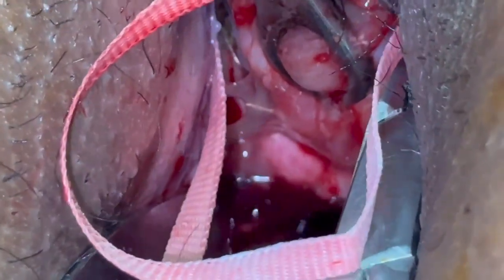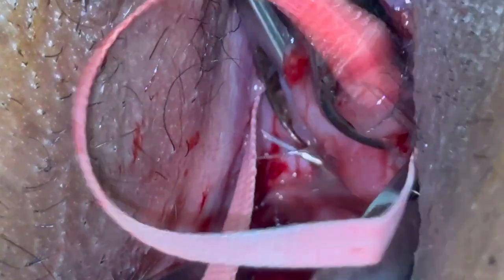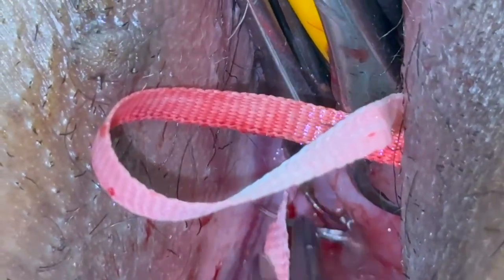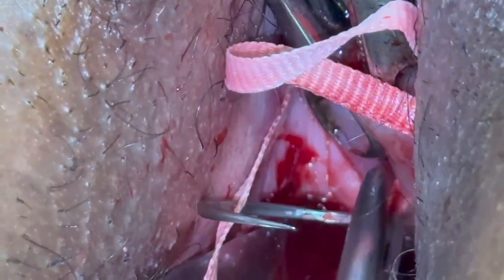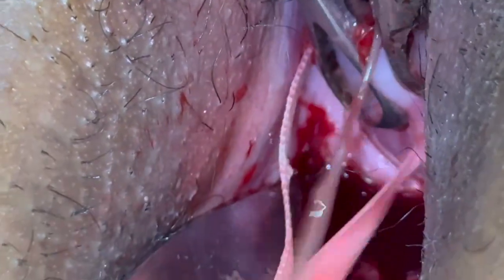The difference between the modified Shirodkar's stitch and the conventional Shirodkar stitch, which we have been taught, is that the posterior knot is kept exposed in the vagina in the modified stitch.